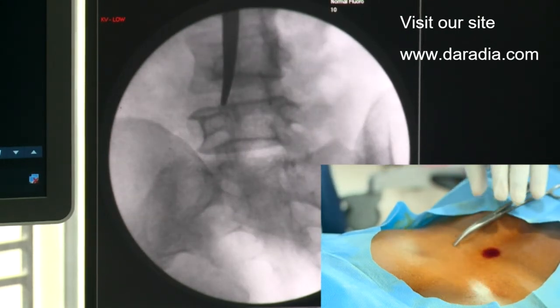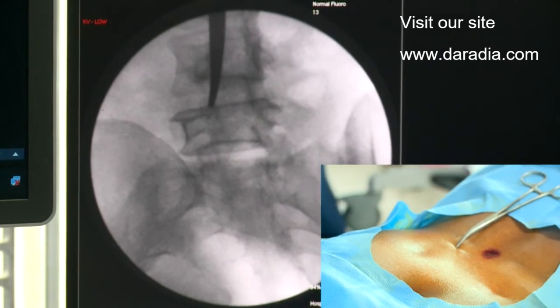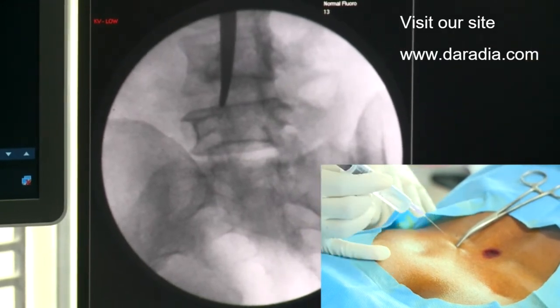The facet joint is bounded laterally by the superarticular process and medially by the inferarticular process. So now my facet joint is exactly over the target. Let's do it.